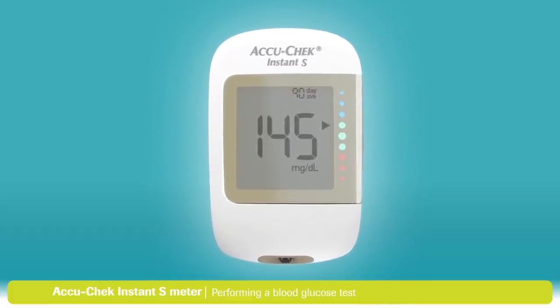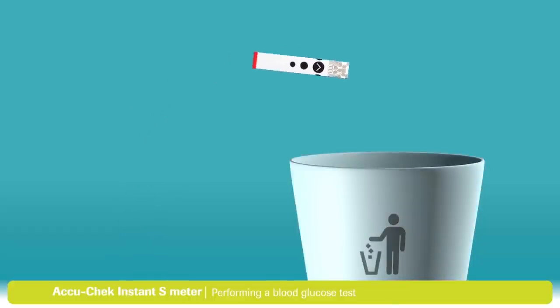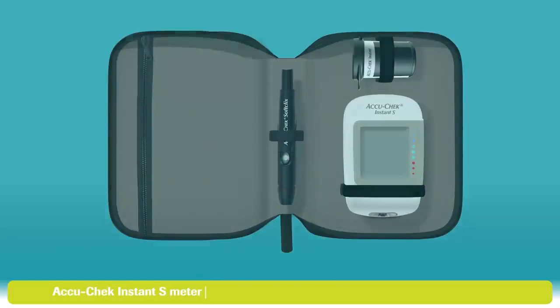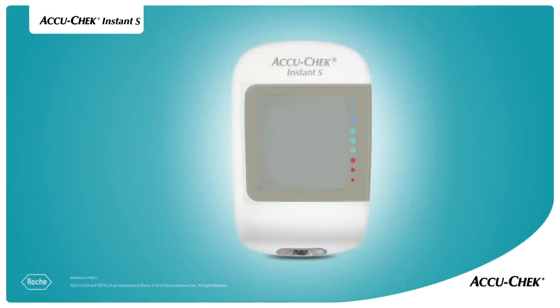One important final step: remove and dispose of the used test strip, then put everything in the carry case. You'll find more information in the user's manual that came with your meter. If you still have any questions, please visit accucheck.in. Thanks again for choosing the AccuCheck Instant S Blood Glucose Monitoring System.